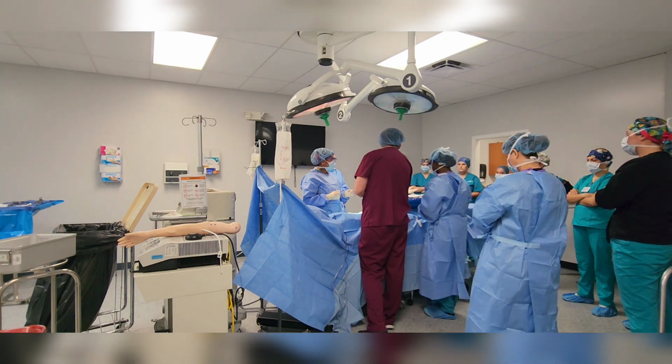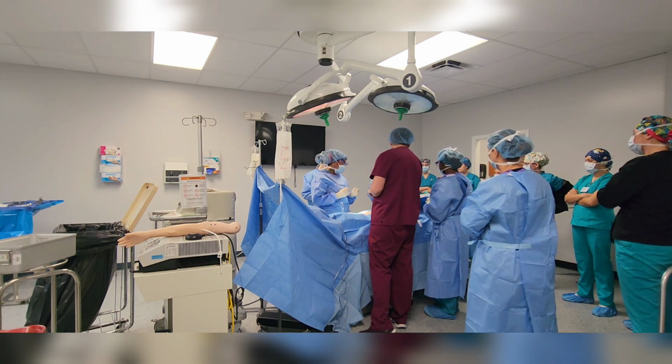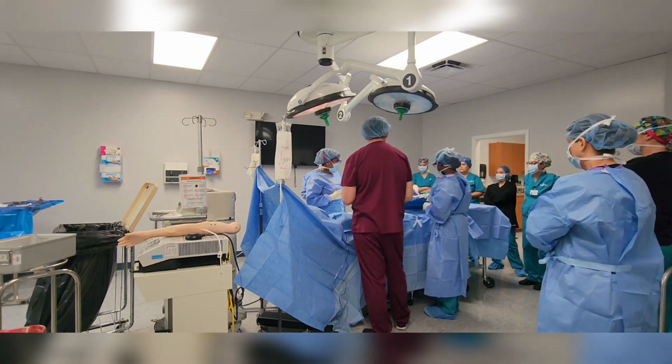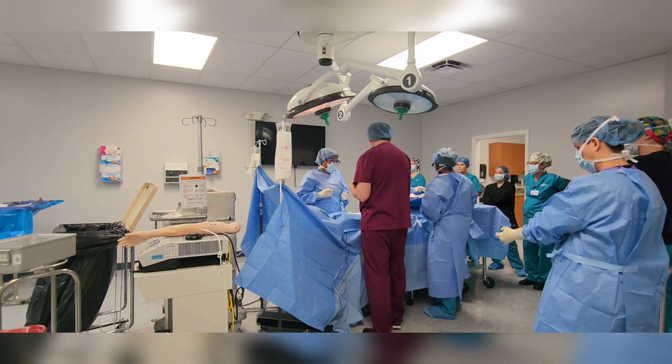So your job is to keep an organized chaos. So wherever that is, you put that on your sharps box. And we're done with that blade. You can put that back. If you're done with something, just put it back. We have already made incisions. Just start putting stuff on your back table. And then quickly organize that little stringer, and then we're going to go through this routine real quick.